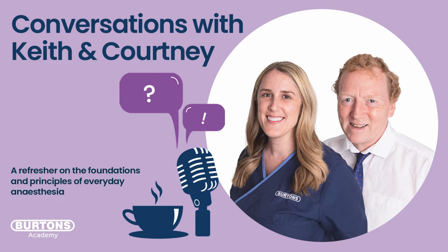You also have effects on blood perfusion in the brain, and control of cerebral blood flow is very much dominated by CO2. So there are a whole host of knock-on effects of that CO2 coming out of range. It is quite amazing that we look at our number on a screen and see a nice normal number or a really abnormal number, and we forget sometimes that a CO2 of 55 to 60, because our patient is hypoventilating, will have global effects in the body.